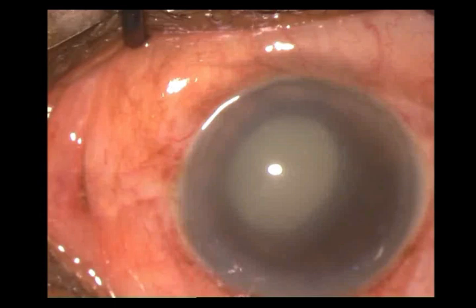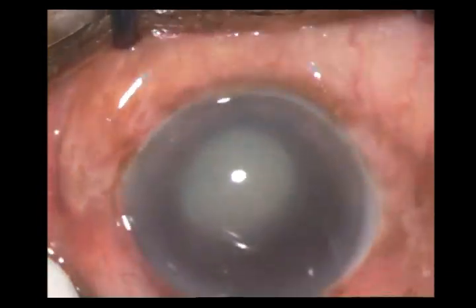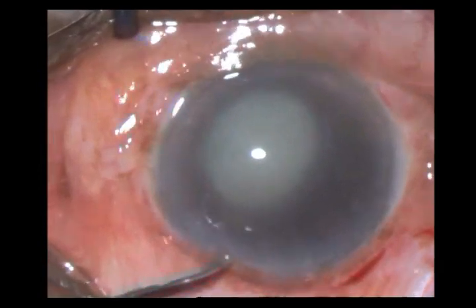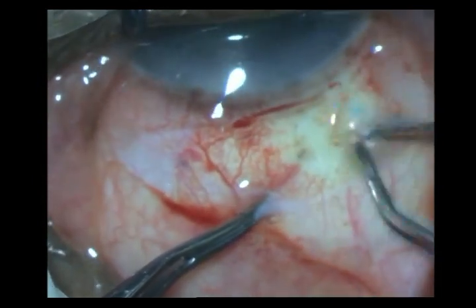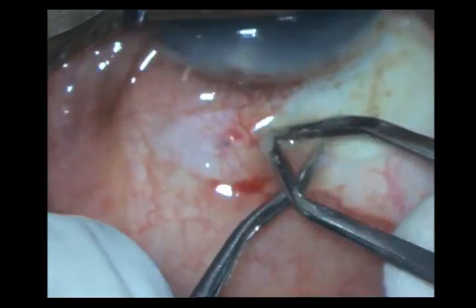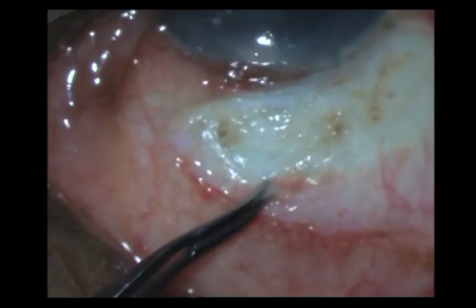I initially planned for a small incision cataract surgery. I am doing my peritomy, and once I have done the peritomy, I do a sort of a steam-roller cautery. I then use my limbus as fixation and go ahead and fashion my frown incision.